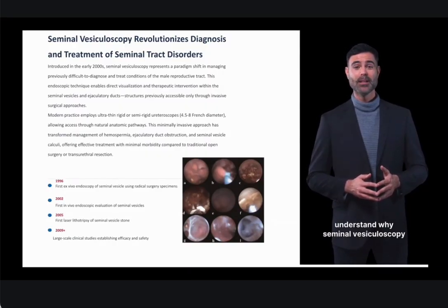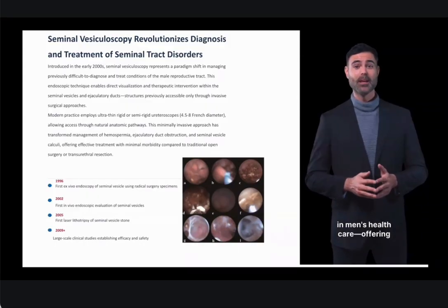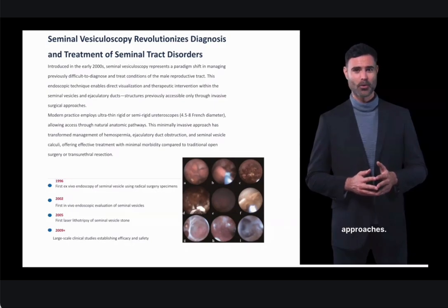By the end, you'll understand why seminal vesiculoscopy represents a significant advance in men's healthcare, offering superior outcomes with minimal complications compared to traditional approaches.